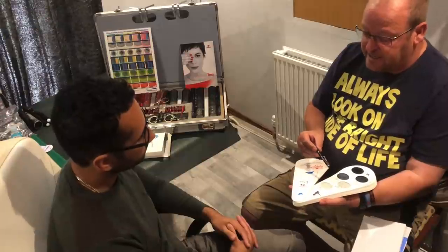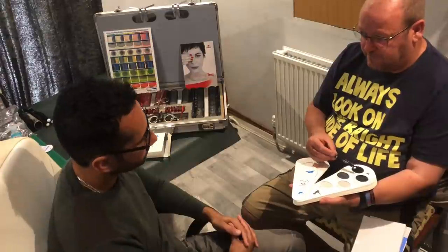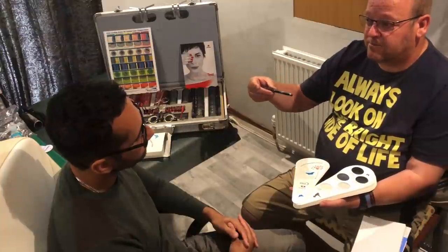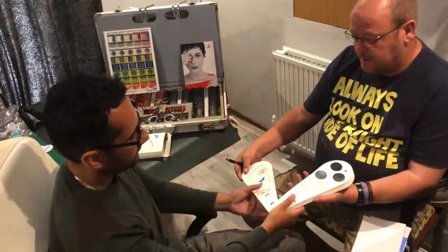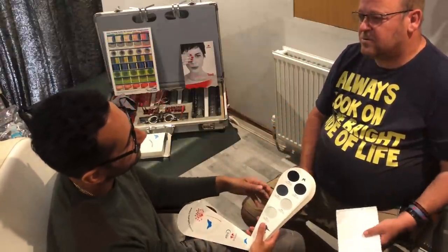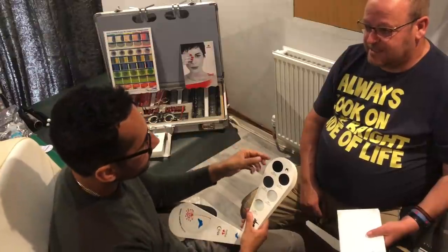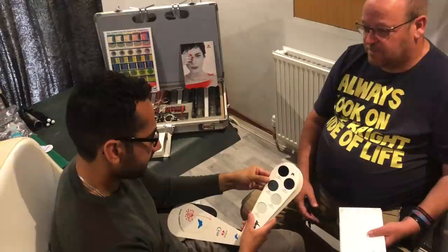It's the same category — what you can wear day and night, even with the grey as well. So with the grey lenses, everything will appear darker but colours will stay the same. Could there be more glare with the grey compared to a brown? Not really, because you're taking the light itself away. But you can have the effect of it appearing to be darker than the brown when you're looking at something.